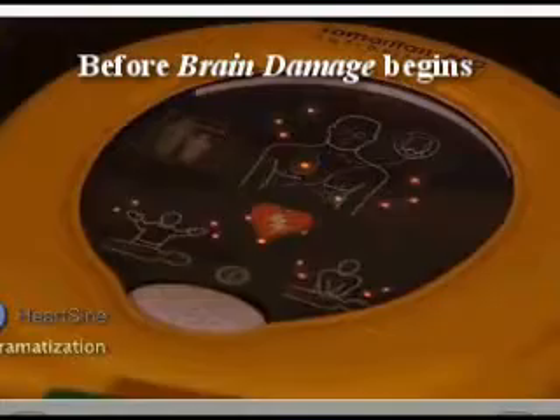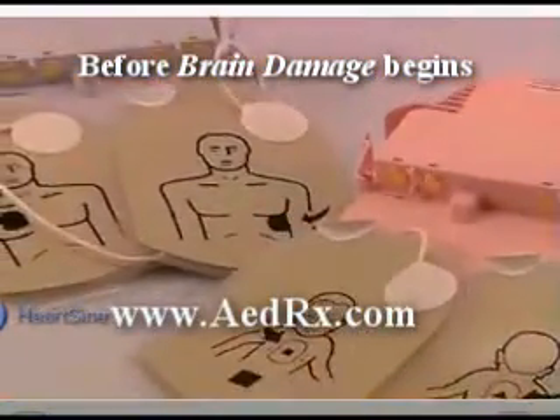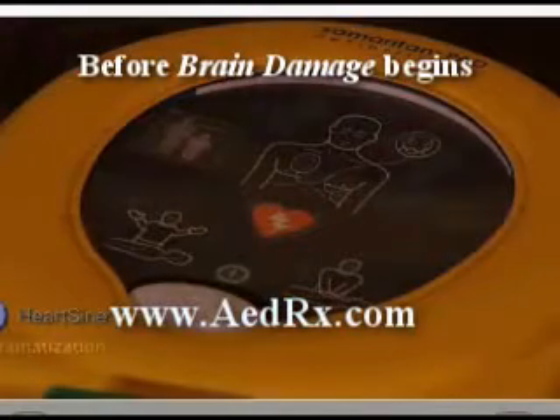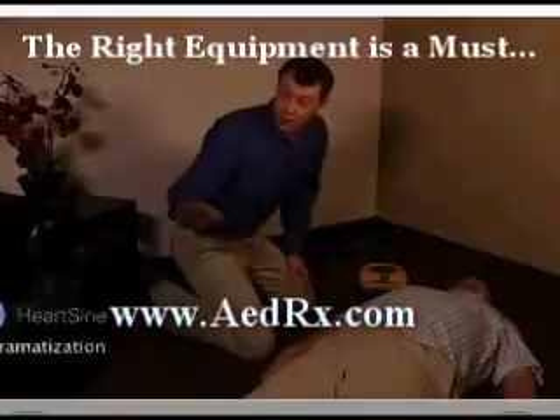Press the green on button. The device will identify an adult or pediatric patient based on which pad pack has been inserted. Adult patient — call for medical assistance. Did you call 911?